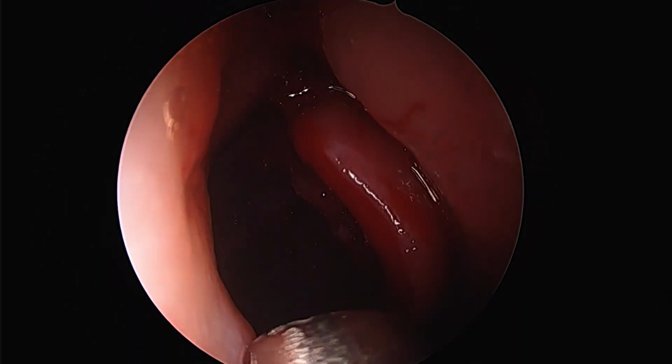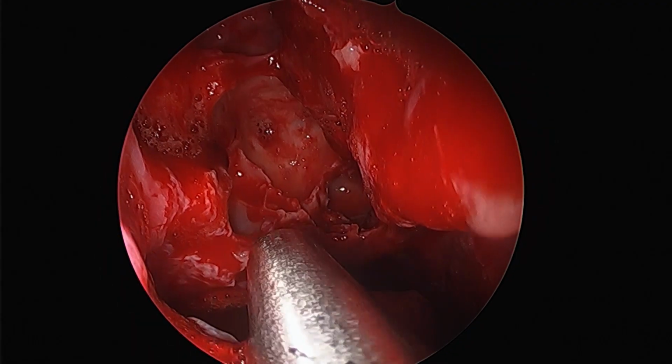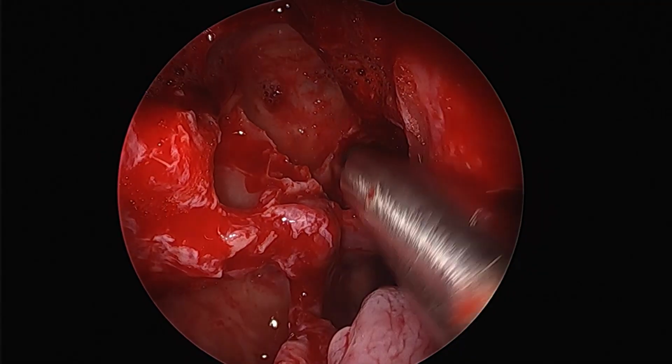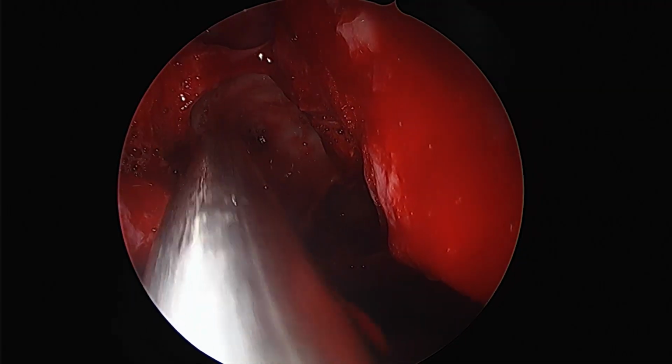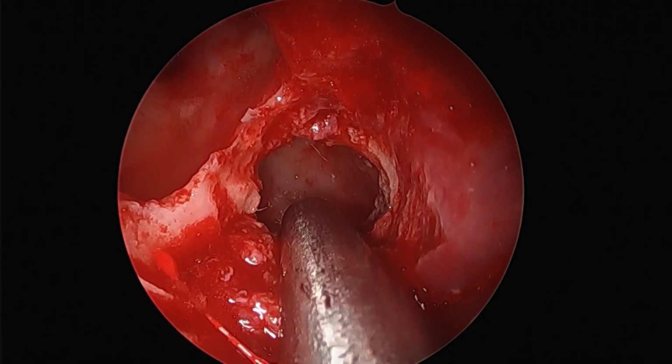Now, as you can see, the surgery is nearly complete for us. The sphenoid sinus does not seem to have any fungus inside it. Maybe what was shown on the CT scan was just secretion, and it has been conclusively opened. The antrum is open. So are the ethmoidal complex, the anterior and posterior ethmoids. The frontal sinus is not involved in this patient, so we would not be really going there.